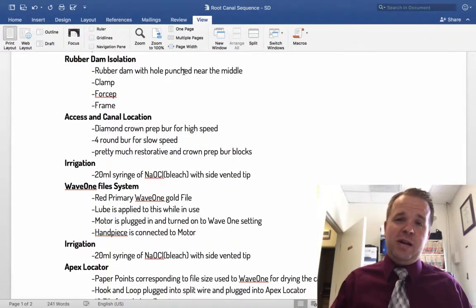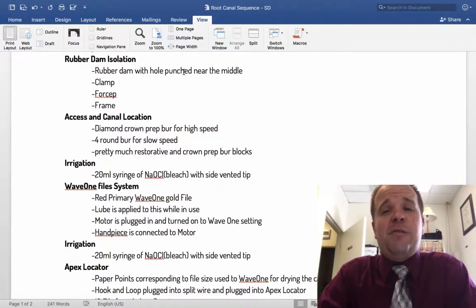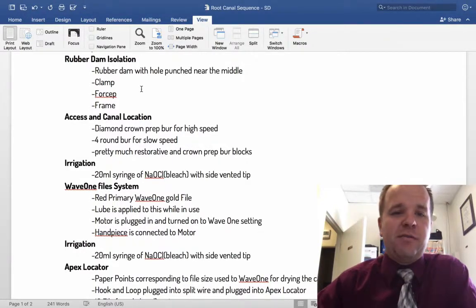I've had a few root canals myself, and I know that it doesn't smell very good when they're cleaning out infection in there. So there's a lot of good reasons for putting on a rubber dam. Not only that, but it's illegal to not use a rubber dam. So you want to make sure that you have a rubber dam on there.